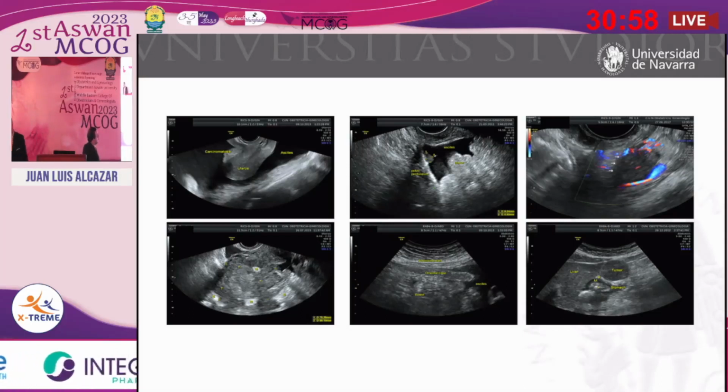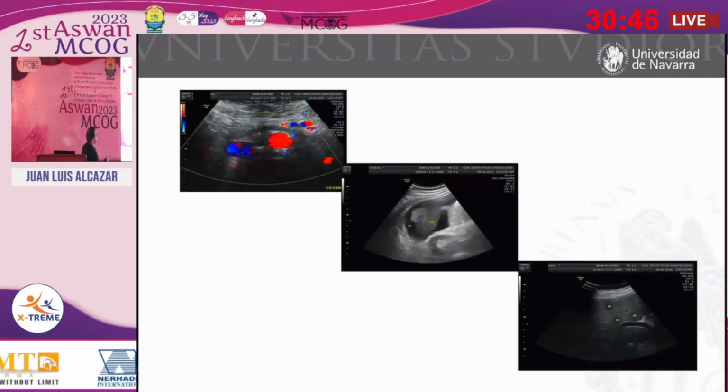Here the tumor, this is the stomach, this is the liver, this is a major omentum, this is again a rectosigmoid, this is a pelvic lymph node, and this is a para-aortic lymph node. This is the aorta. This is the vena cava. And this is a lymph node in between. This is tumor on the surface of the liver. And there are metastatic nodules within the liver.